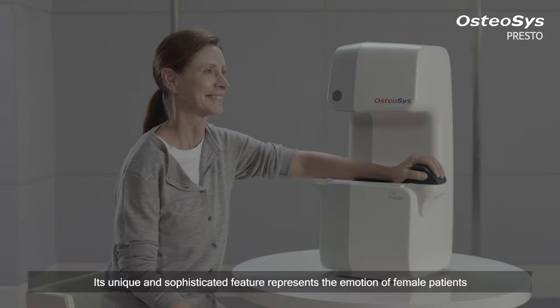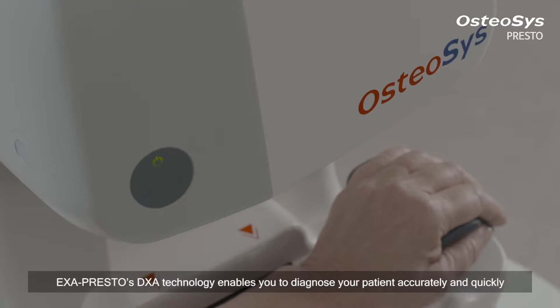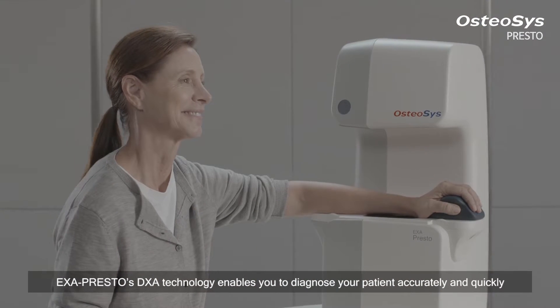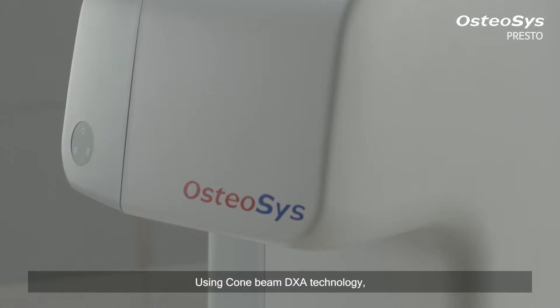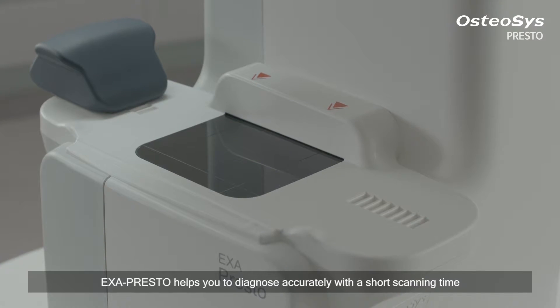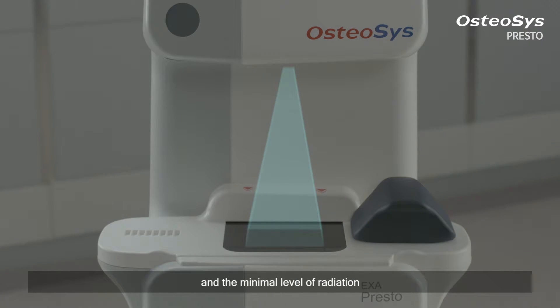Its unique and sophisticated feature represents the emotion of female patients. Exapresto's DEXA technology enables you to diagnose your patient accurately and quickly. Using cone beam DEXA technology, Exapresto helps you to diagnose accurately with a short scanning time and the minimal level of radiation.